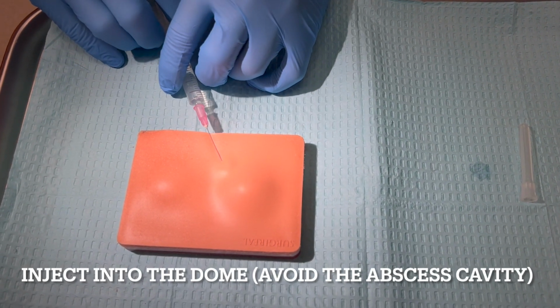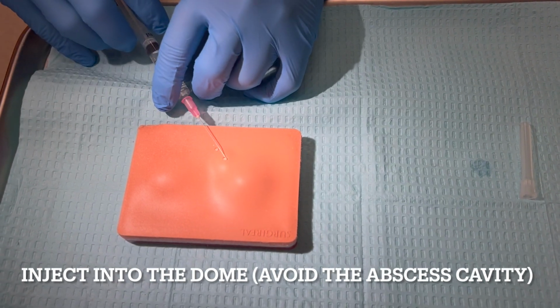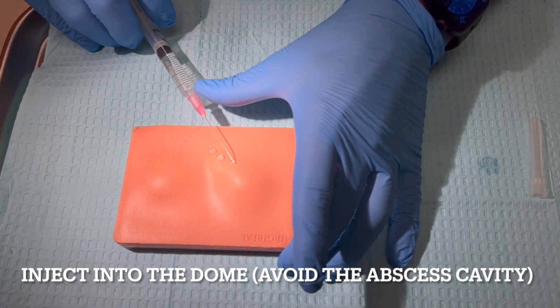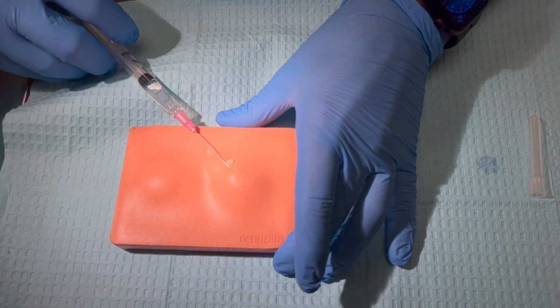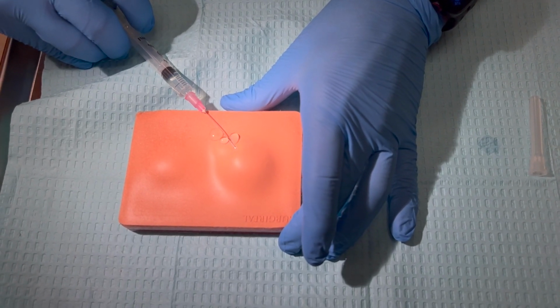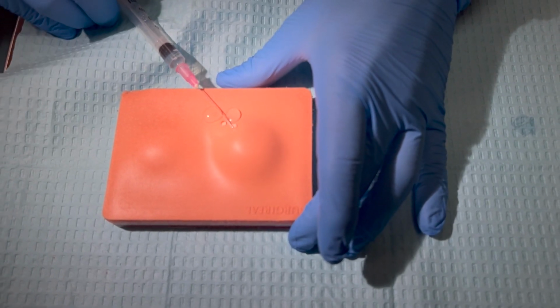Come along, we want to be conscious to inject the medication within the dome of the abscess, keeping very superficial. Again, this is where our scalpel will be inserting, and we want to have the area as numb as we can. Going too deep within the cavity can result in a premature rupture of the abscess, which can be downward into surrounding tissue or outward toward the provider.